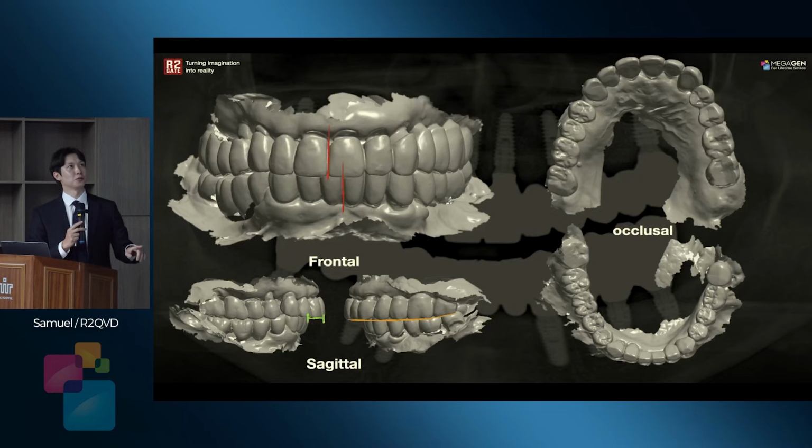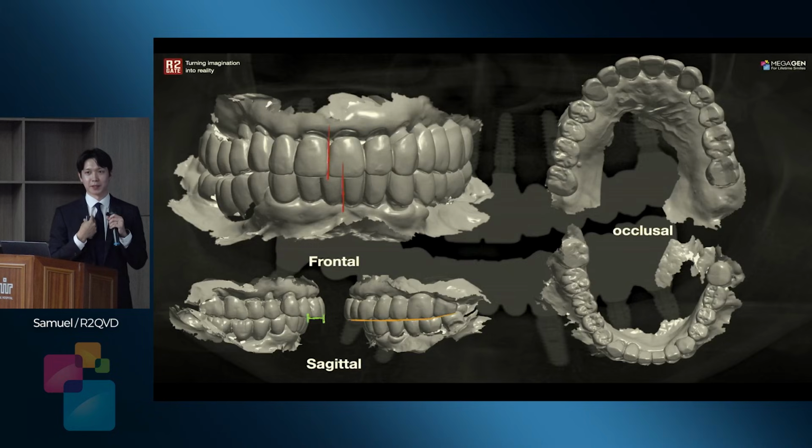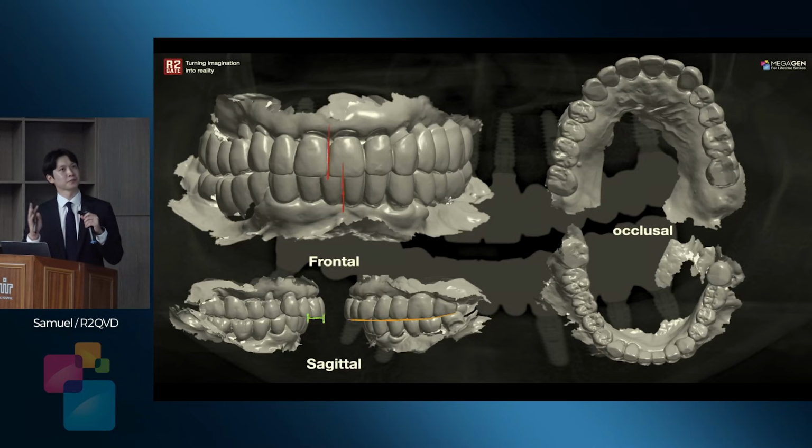At the time, I do implant planning. So this doctor sent me, it's not Dr. Park's case actually. This dental staff sent me the scan data first, upper and lower and occlusal. And she said my dentist ordered to do all extraction upper and lower, then place the whole crown with the implant. We want to do all-on-X surgery.